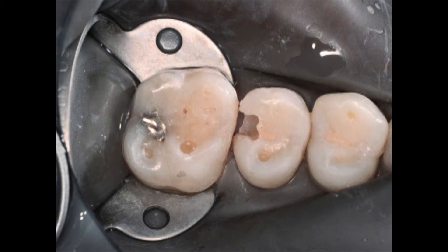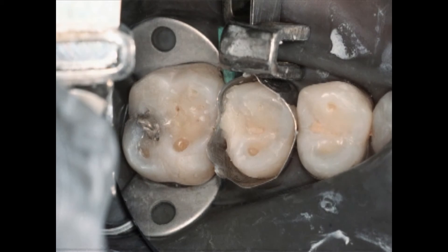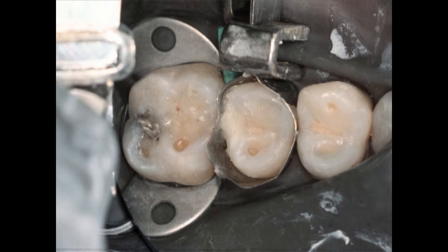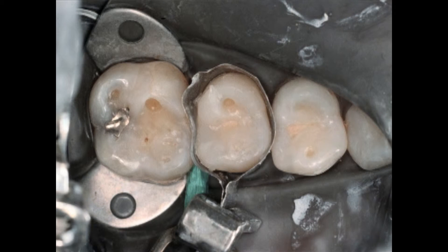We've cut our preparation, and notice I didn't take much care in putting this composite in here — I have more composite than I need. But if I'm careful about how I go ahead and acid etch, you're going to see I have some flash over here and over here. That flash is going to be easy to remove if I don't acid etch the entire tooth — I'm just acid etching about a millimeter beyond where my cavity preparation margin ends.